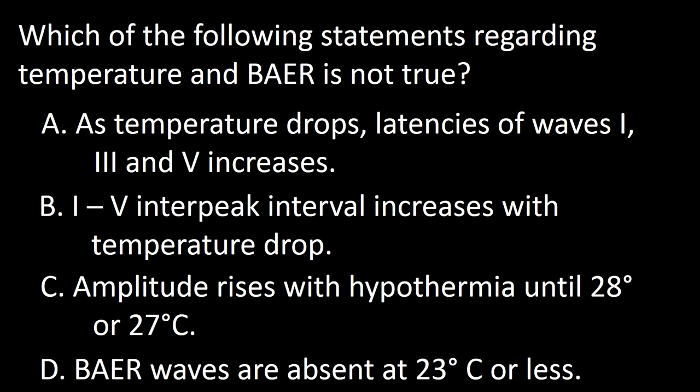Next question. Which of the following statements regarding temperature and brain auditory evoked responses is not true? A. As temperature drops, latency to wave 1, 3, and 5 increases. B. 1 to 5 interpeak intervals increases with temperature drop. C. Amplitude rises with hypothermia until 28 degrees or 27 degrees centigrade. D. Brain auditory evoked responses waves are absent after 23 centigrade or less.